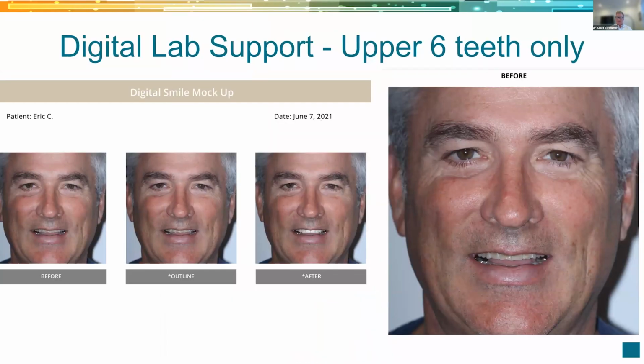Push of a button. You might do this yourself with some kind of mock-ups with Adobe, all sorts of software, apps, labs are available. I love, for 20 bucks or so, I send this to the lab and I say, hey, make Eric look pretty by just giving me a mock-up for his upper 6 teeth. This comes back. I can share this with Eric. I don't have to do the emotional mock-up in the mouth anymore. I can share it with him this way.